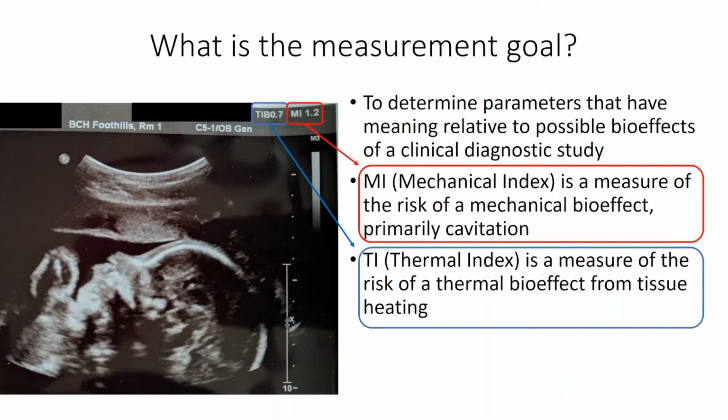The primary goal of measuring the acoustic output of imaging systems is safety. As shown on the slide, there is a baby there. Dr. Ellens and his wife are about to become parents. I believe the image on this slide, of course, is their unborn baby. I believe Nick's personal circumstances provide an excellent example of why the display of acoustic output parameters and measurements to determine them are important.